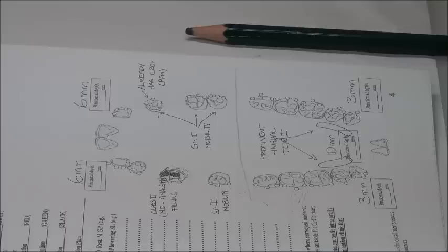But also, it has a problem: the gingival approaching direction of force is unfavorable, so I usually go for the RPA system. It's preferred. Why? Although RPI is a stress-releasing design, the vertical direction of the force is stressful on the tooth, so we change it to an RPA system with grade 1 mobility.